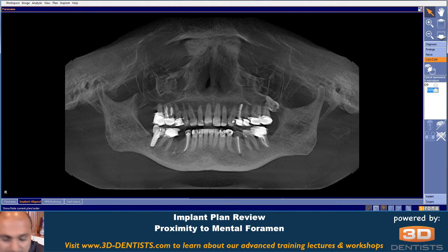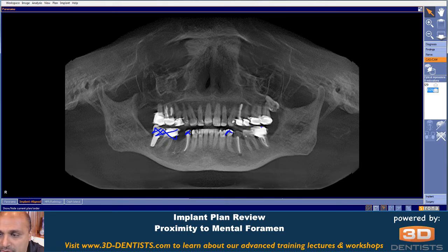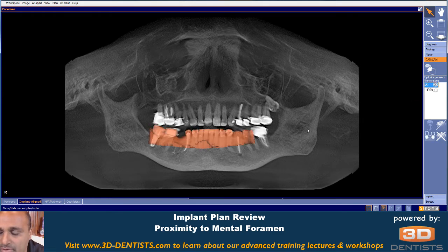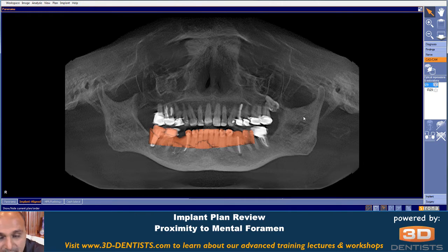What I see is a tooth here that cannot be used, and several others that cannot be used either. But I do see teeth right here that can be used to integrate my CEREC data in for this situation. So with that being said, this would be a digital workflow. The digital workflow is predicated on being able to successfully and accurately integrate the CEREC data into your cone beam data.